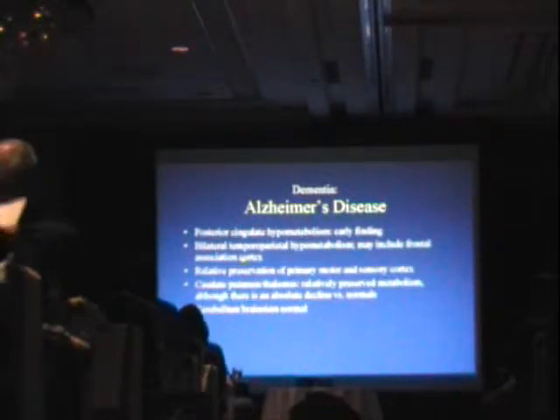That's the paradigmatic area for that. You sometimes may see something also in the posterior cingulate where you have some decreased perfusion, but that's variable, and I wouldn't rely on that. This is the main finding here.